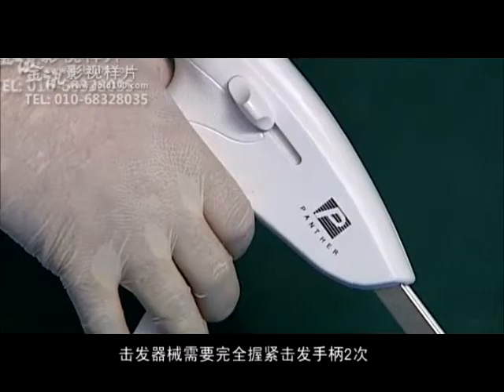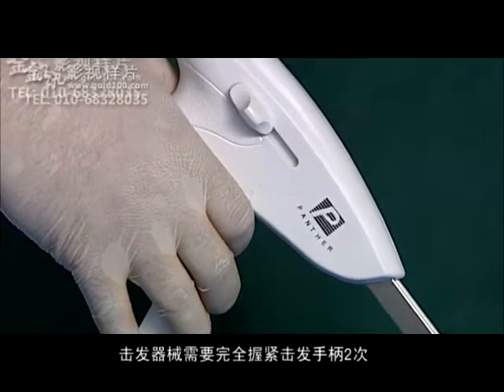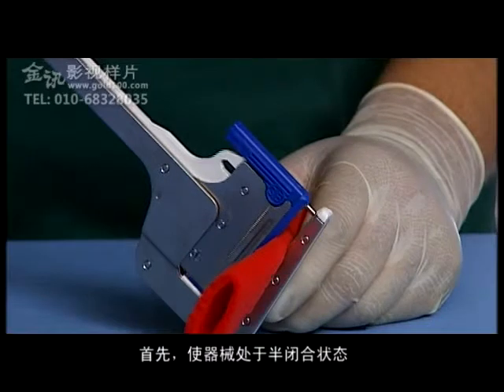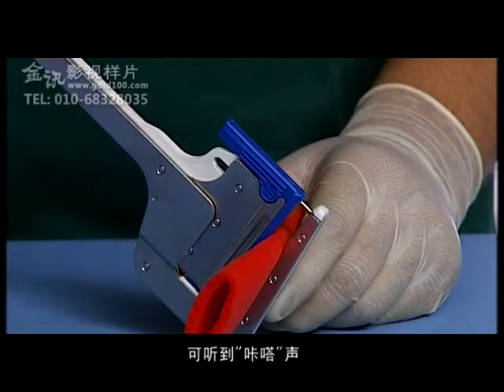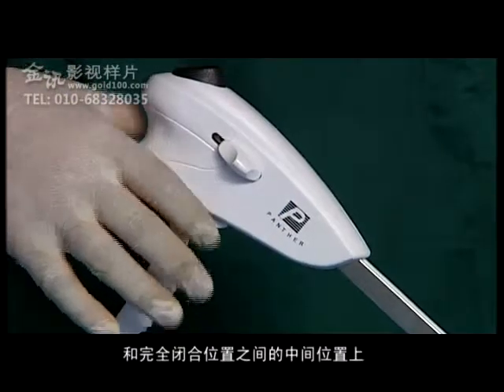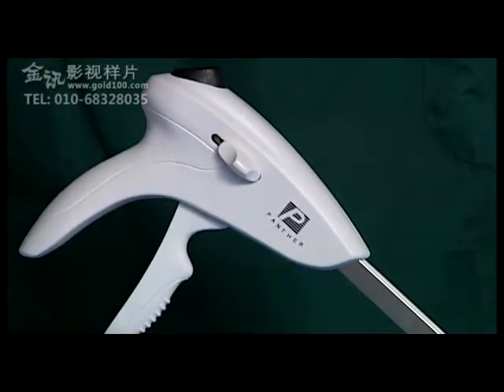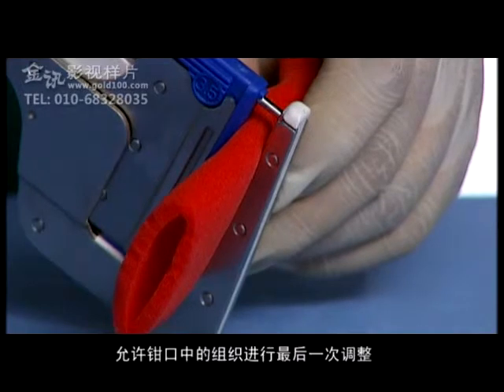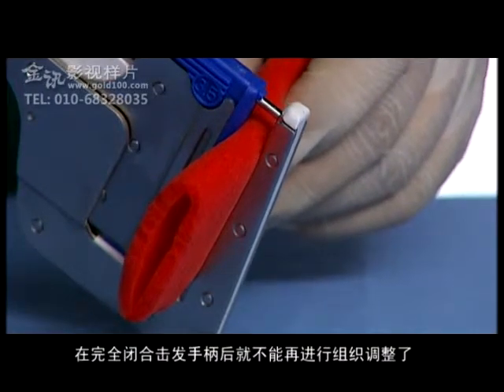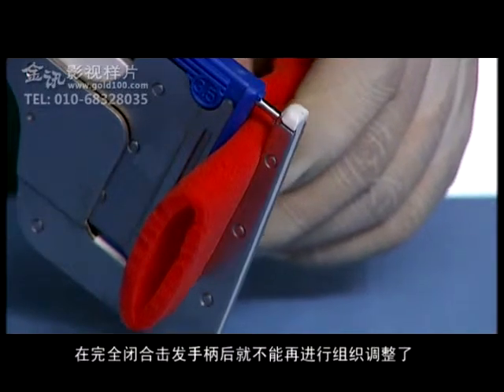Firing the instrument requires 2 complete squeezes of the instrument handle. Firstly, put the instrument in a tactile pre-clamp position. An audible click will be heard. The handle will stop between the original and fully squeezed position. This pre-clamp position allows final positioning of the tissue within the jaws. This is not to be considered as a full squeeze of the instrument handle.